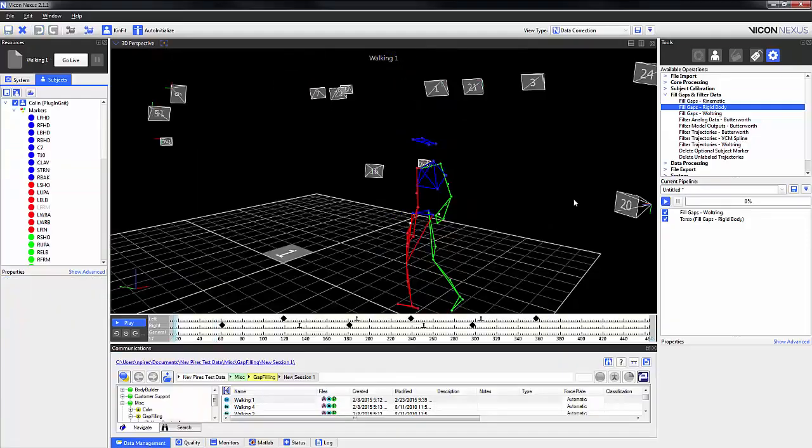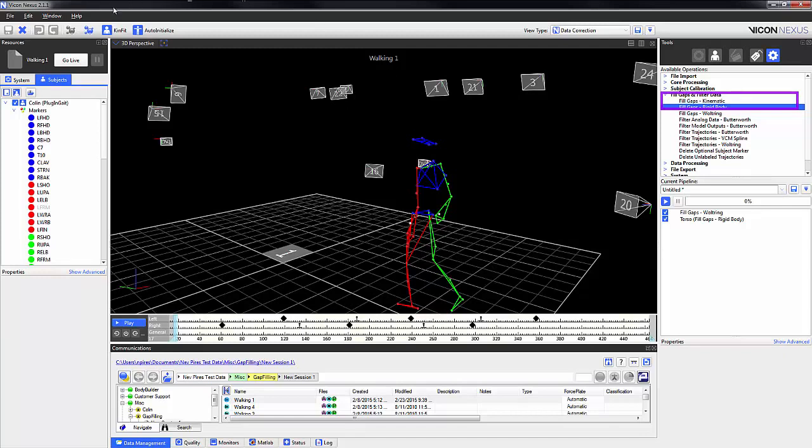The same principle applies to the kinematic fill gaps. Although in this case we'd need to select the segment.